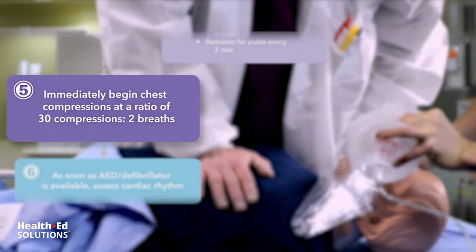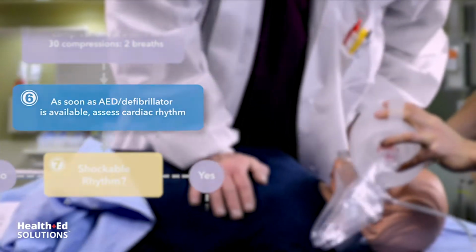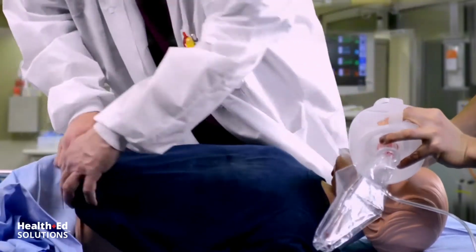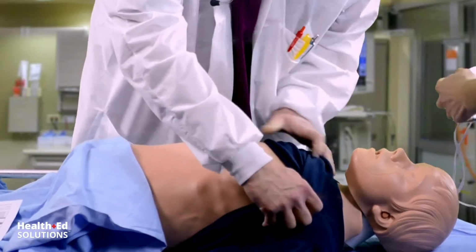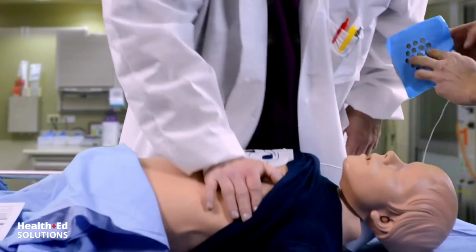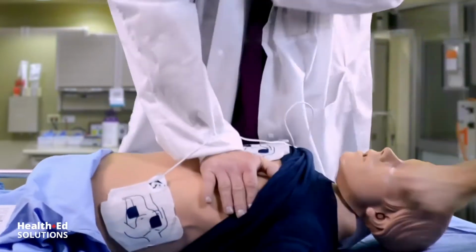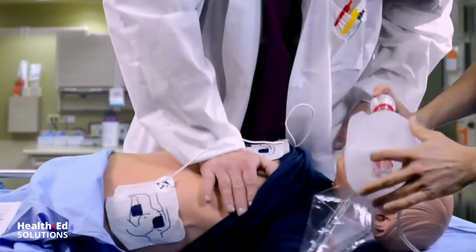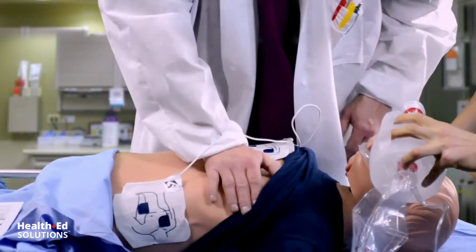Place electrodes. The AED's here. Place electrodes. Pads on him. Place electrodes. Do not touch patient.